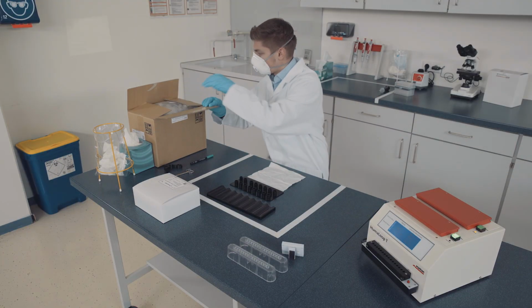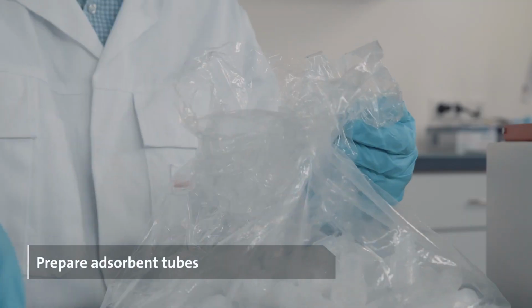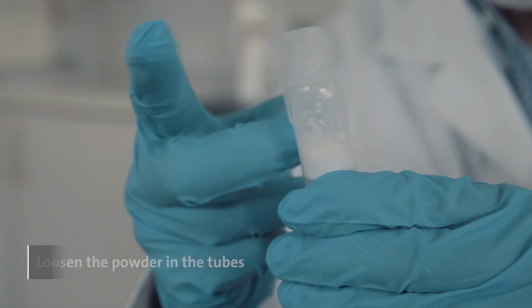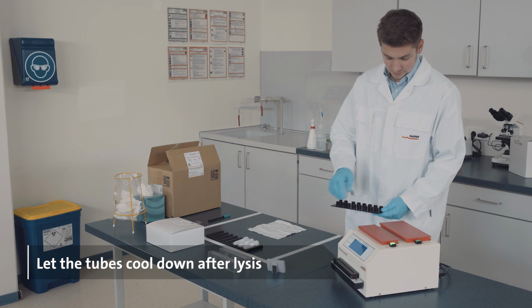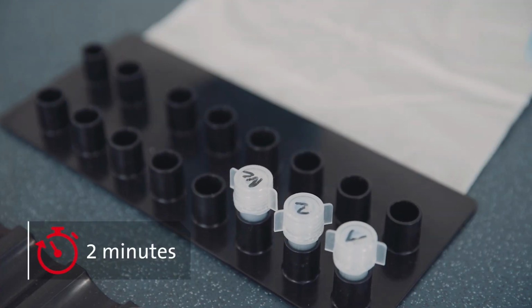Take out the plastic bag with the adsorbent tubes and prepare the appropriate number of tubes. Try to avoid reaching into the bag. Loosen the powder in the adsorbent tubes. After completion of the lysis process, remove the tubes and let them cool down for about 2 minutes.